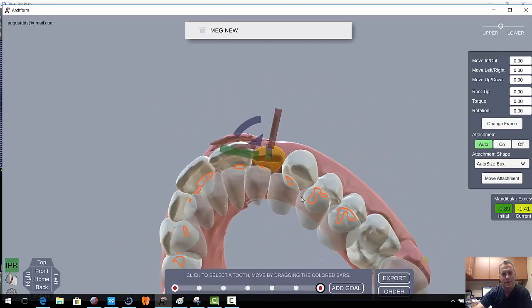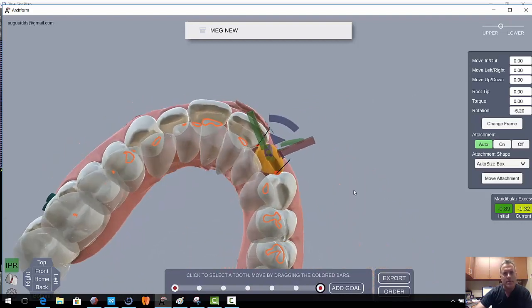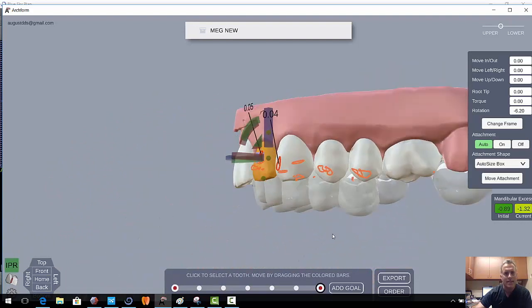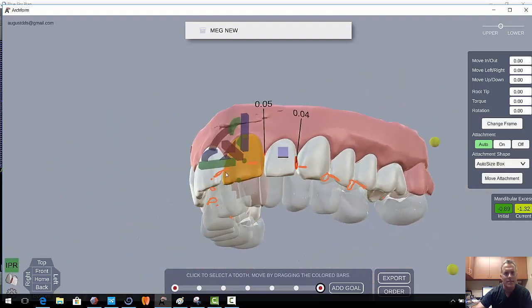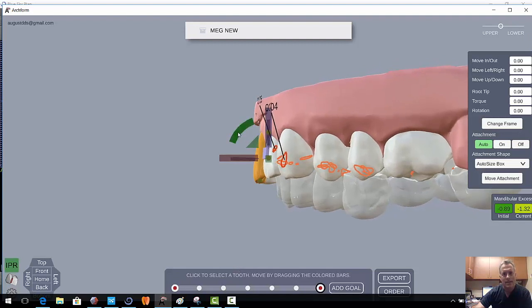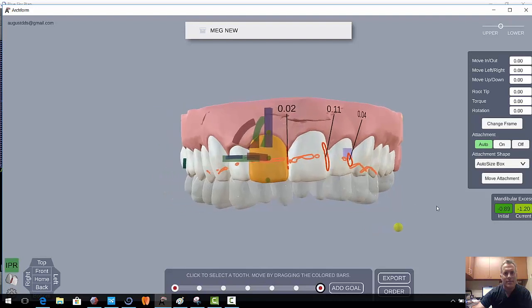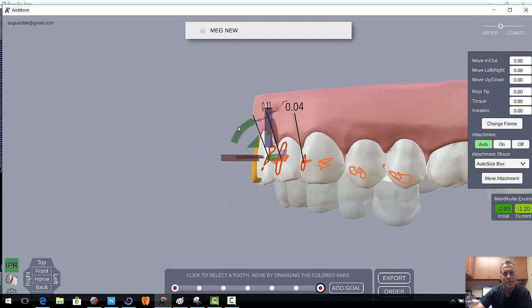But let's go ahead and fix this one. So we're going to rotate it. This one looks pretty good on the other side. So now we're going to work on these two anterior teeth and try to pull that down and back. You can see the IPR adding up as we move these teeth back into the arch.